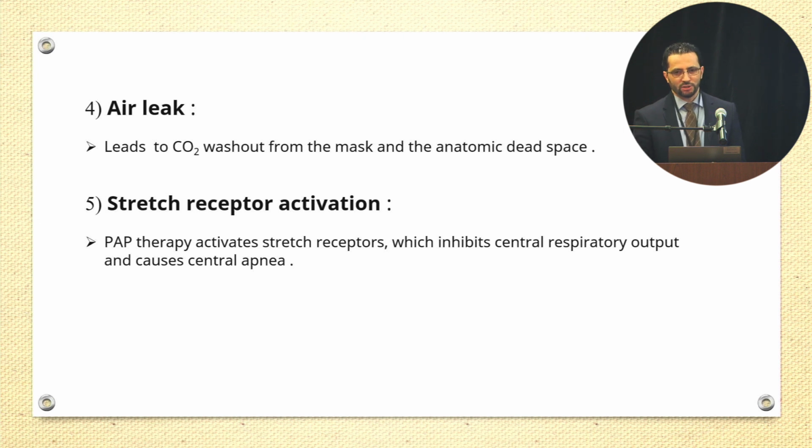Air leak also washes out the CO2. Remember when we said intentional air leak? Air leak is meant to wash out, not to have us rebreathe our CO2. If you have too much air leak, that means you wash out the CO2 more. You need that CO2 to breathe as well, so that causes you to have some centrals.